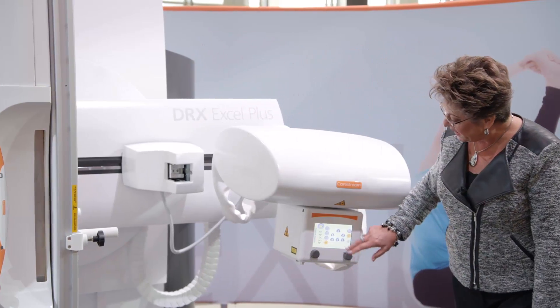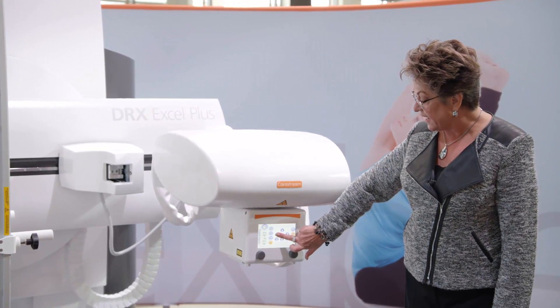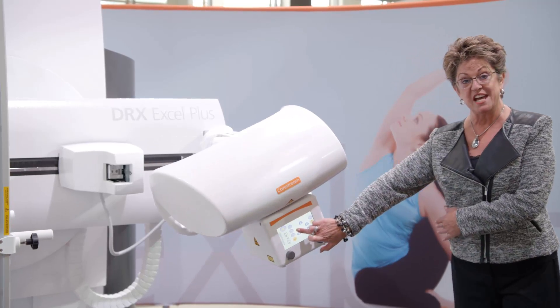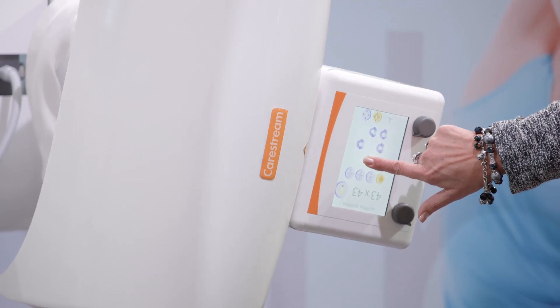It also has 180 degrees of rotation. So if I do need to continue to angle, I can actually do a wheelchair test, a cart test, a shoot-through image in this direction as well.